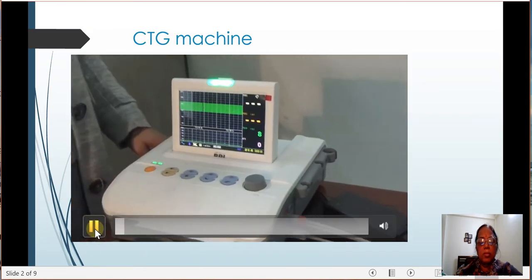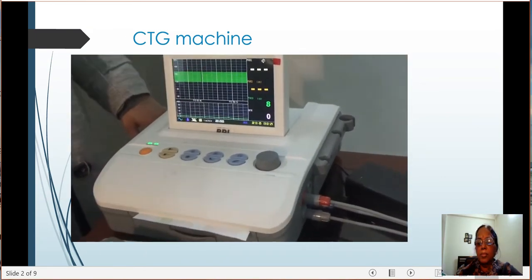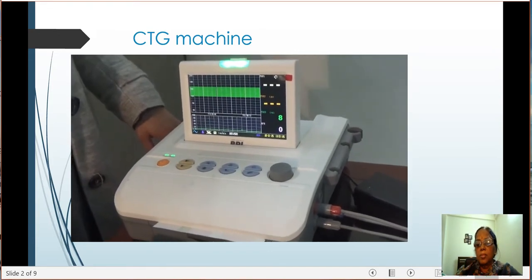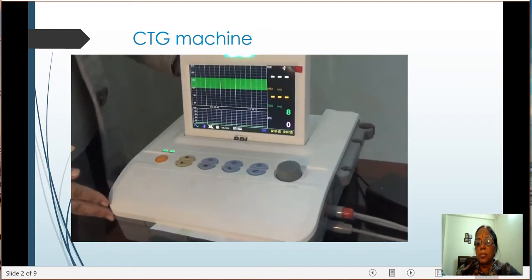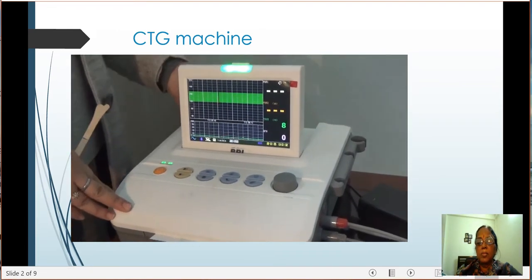Today we are going to talk about the non-stress test. So before going to the procedure, we would like to discuss the parts of the NST machine. Here we can see all the parts have been displayed over here. This is the NST machine on the whole.